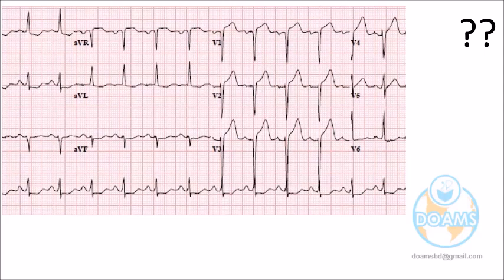Is the P wave abnormal? Double P wave or two P waves? Double P wave or double peak, you mean? Yeah. In which lead are you looking? I'm looking at Lead 2. Lead 2, yes. Seems to be, though not much clear. It is the limitation of our projection as a slide. Okay. QRS is okay? QRS, yes, QRS is okay.